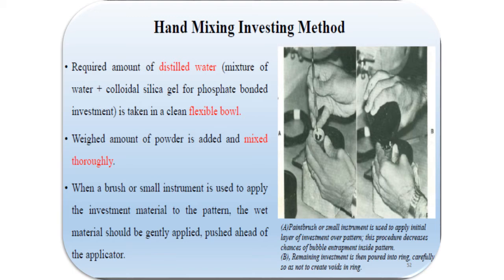Now here we need to understand one important aspect. The preparation of a tooth intraorally by using the high speed rotary instruments, as well as capturing that intraoral tissue detail with the impression material and making of the wax pattern. For that we use different types of pattern waxes, for example inlay wax, and then transferring that wax pattern into a metal with the help of the investing technique.